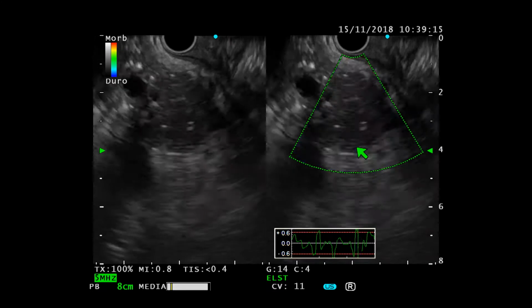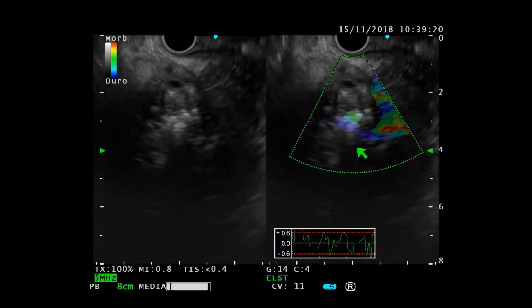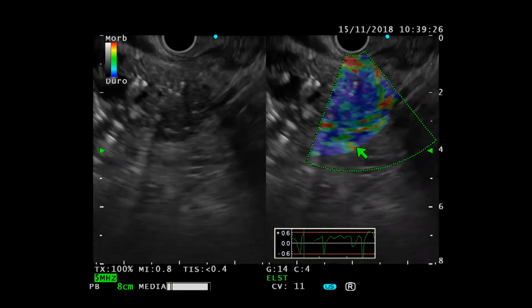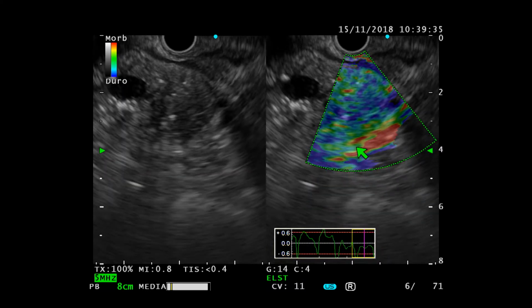Beautiful colors. Can you please explain for non-experts like me? There is a stiffness of the tissue. What are you looking for? As you see, the lesion we are looking for is quite blue, a mixed blue and green color.